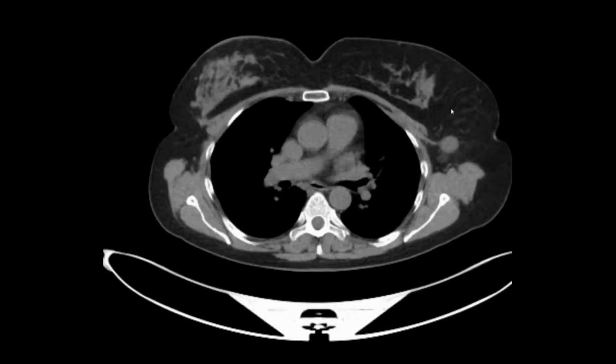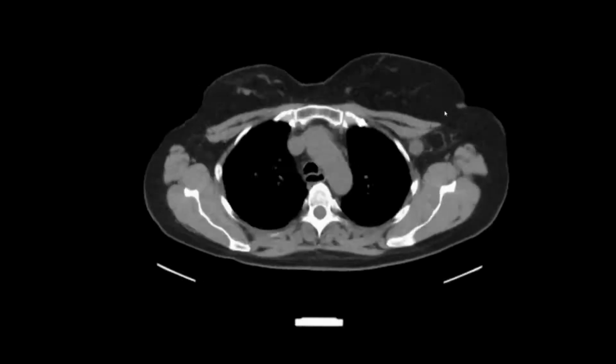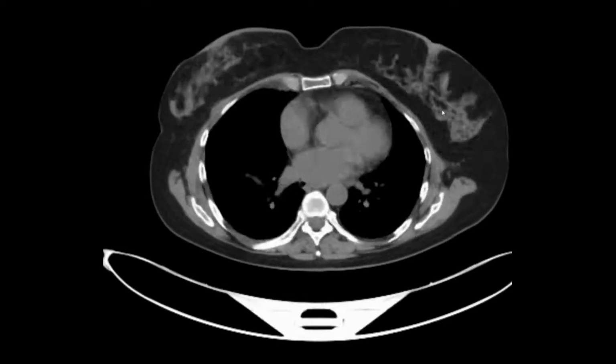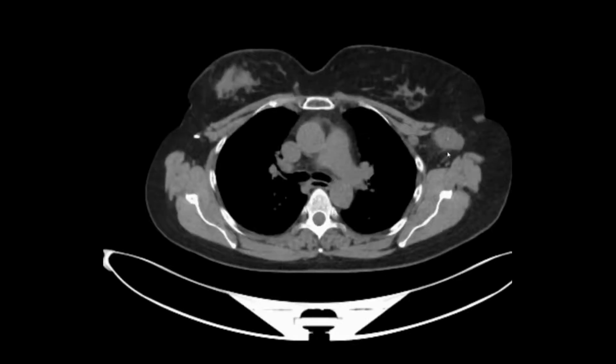By eye, I don't see any weird nodularity here or any spiculated mass that is going to necessarily show me that something is there. But this would be further worked up, of course, by diagnostic breast center. What I do know are these abnormal left-sided axillary lymph nodes. And as you can see here, as we discussed before, size doesn't really matter as much as morphology. And in this case, this is a blatantly abnormal lymph node that has a central calcification, it appears, right there.